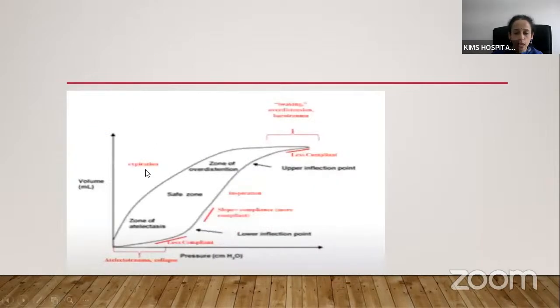This middle zone is the safe zone. Here only we should try. We should try to avoid both the zone of atelectasis and the zone of over distension.